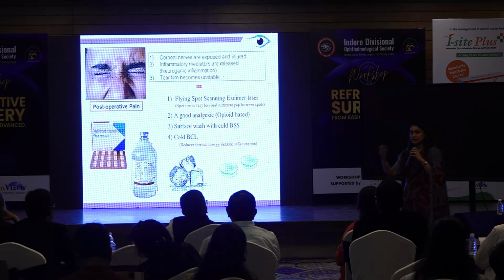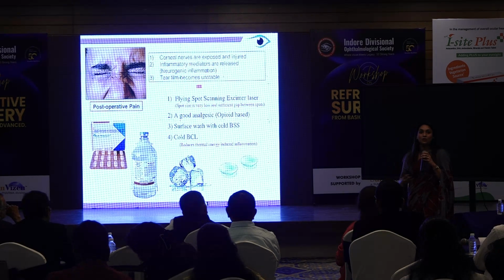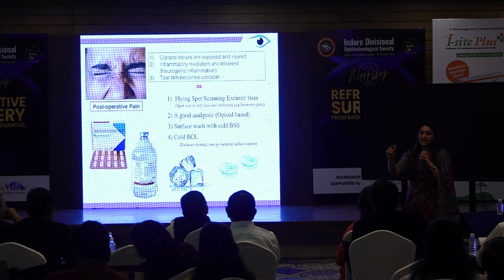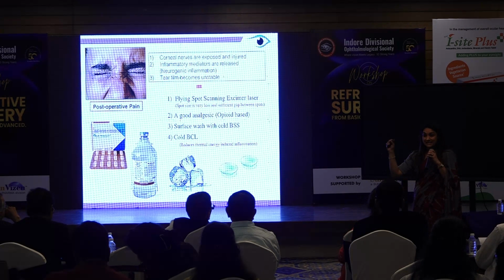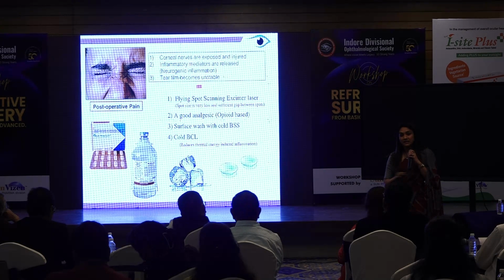And of course, with more understanding of the use of cold BCL and cold saline, the pain is drastically reduced. So I practice the same thing that Dr. Rohit sir has taught us, that we put a band-aid contact lens in the refrigerator one night before the surgery is planned, and just once your surgery is about to get over, that's exactly when you remove that contact lens before putting it in the patient's eye. So using a cold saline and using a cold band-aid contact lens really does wonders.